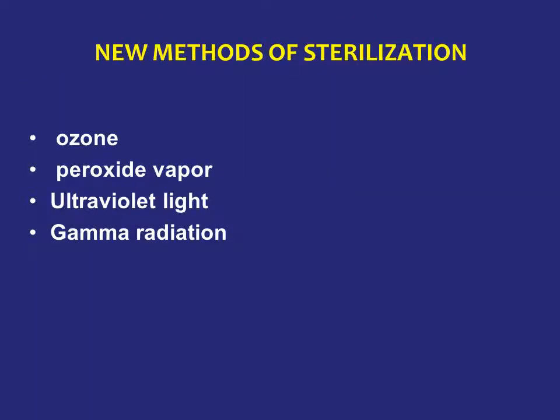There are new methods of sterilization, all under investigation and development, for example ozone, peroxide vapor, ultraviolet light, gamma radiation and so on.